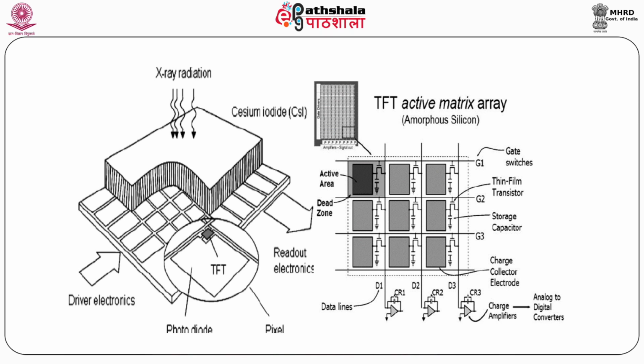Here again we use TFT, either TFT or CCDs, mostly TFTs. That is where the capacitor acts as a storage of charges. The capacitor starts to store the charges, and the charges are read out by using the drain circuit, as I told you earlier.